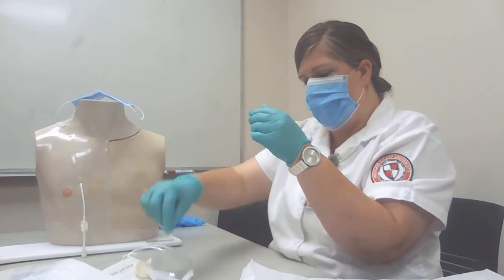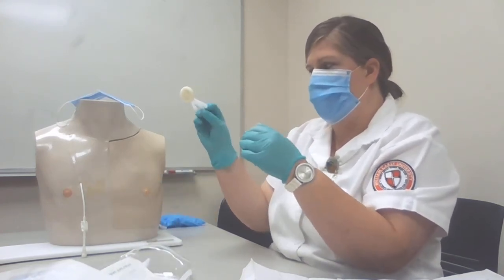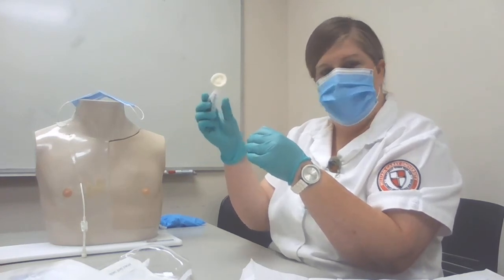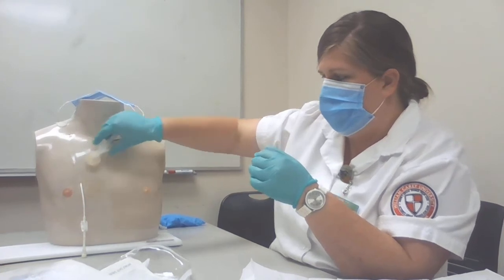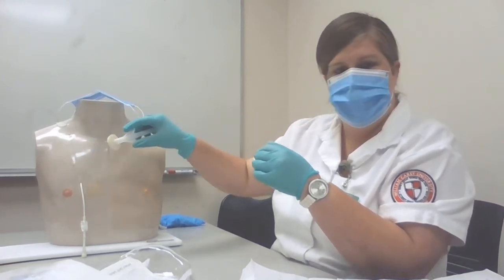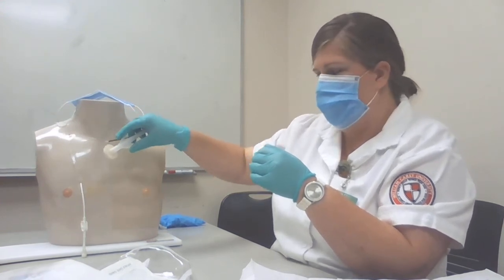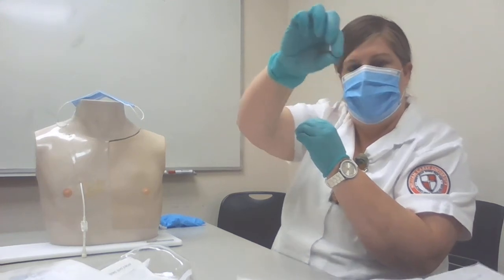Next I would get the ChloraPrep, after the alcohol dried. For demonstration purposes I'm not going to squeeze it, but you squeeze it, and then in a circular motion I'd cleanse from the inside out the CVC dressing site and discard it in a biohazard bag.